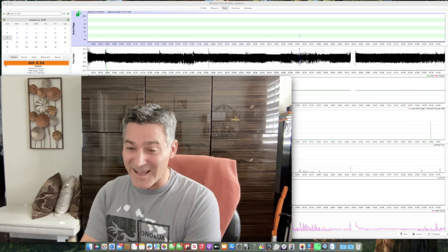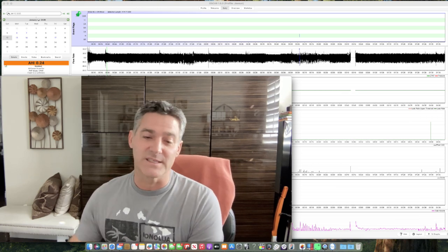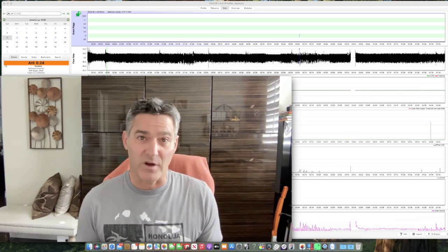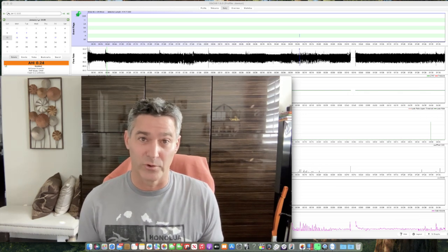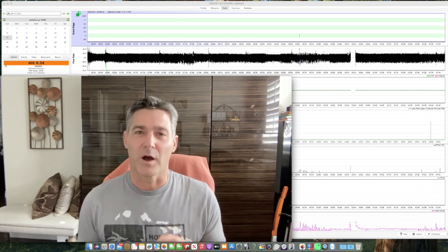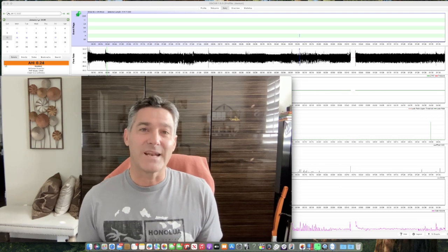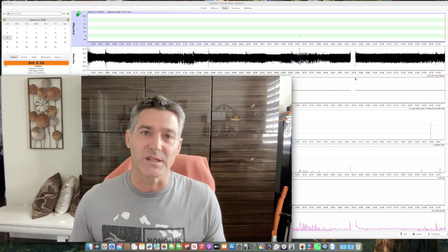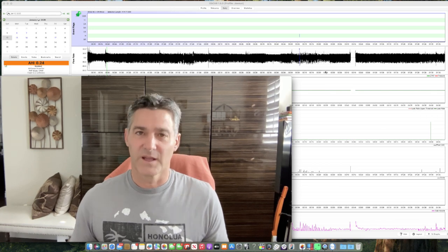And in case I did not mention it, Oscar is a free program. It is free. The developers of Oscar are phenomenal people. They really genuinely have not earned a dime from it. In fact, I think they've lost money having it hosted, though I'm not 100% positive of that. Oscar is an outstanding program, like I said, to unlock what exactly is going on in your sleep and what you can do to improve it. That's all I've got for you.